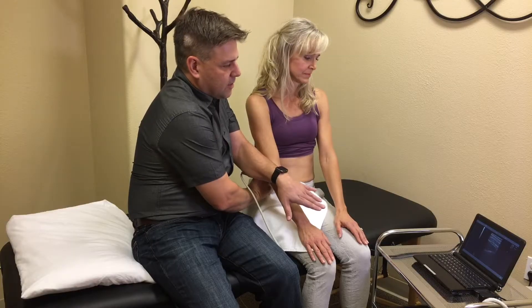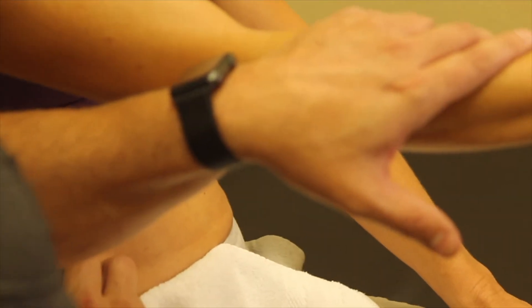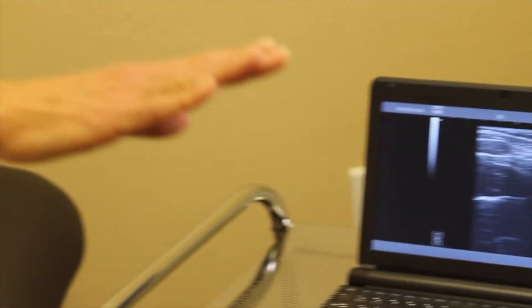We're using ultrasound to actually see the muscles that are working when you are contracting your abdominals, and you might be surprised about what really is contracting and whether or not your core is really working effectively.